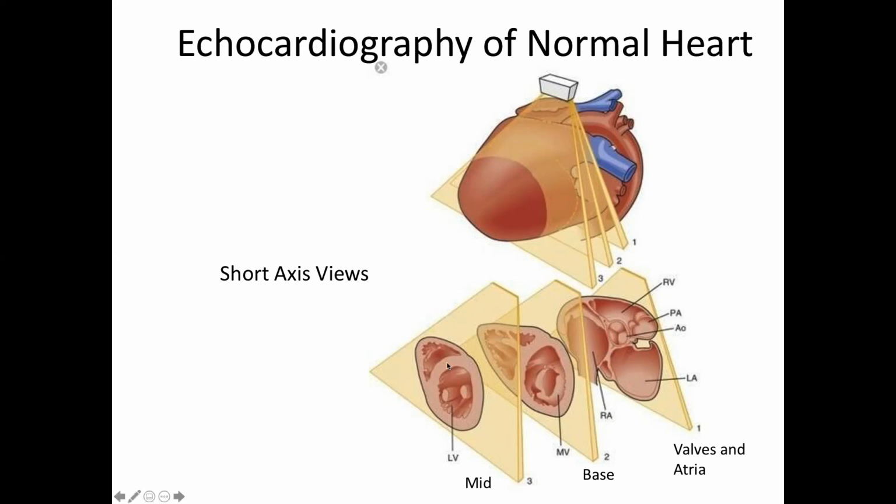When we rotate 90 degrees, we now see the entire circle of the myocardium, and we're able to look at the motion of that circle. It's like a ring in which the inner diameter gets smaller as the blood gets ejected, and the wall gets thicker.